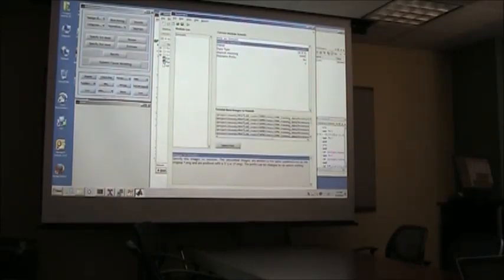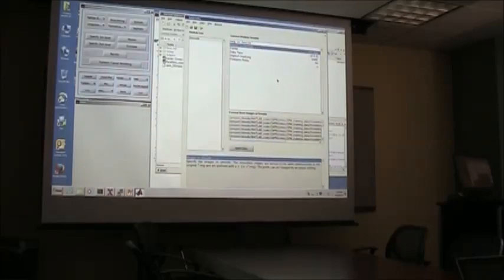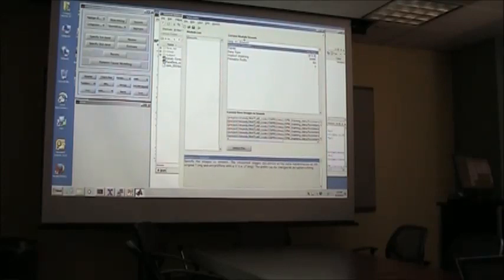It's the last step you would do in pre-processing. Last week we looked at steps like the realignment and the co-registration, I think. In any case, the last step you do in pre-processing is the smoothing of your data.